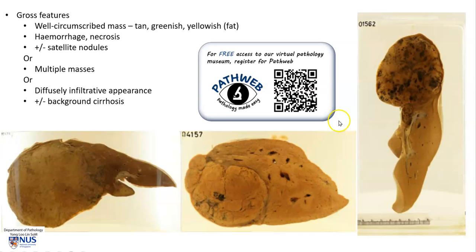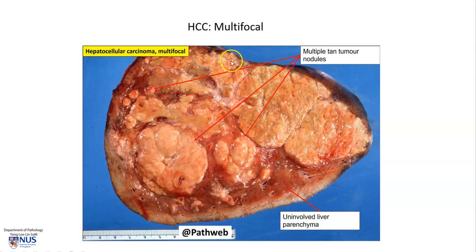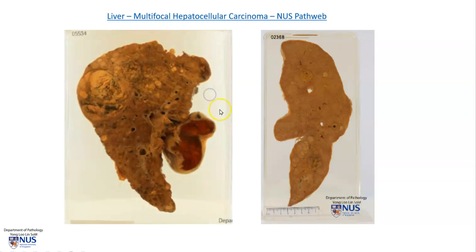All these virtual pathology specimens are taken from our free online pathology resource PathWeb. You can scan this QR code to register, or the registration link is also found in the video description. Here is an example of hepatocellular carcinoma with this fleshy tumor arising on a background of cirrhosis. Here is an example of a multifocal HCC with multiple tumor masses, and in this case the liver does not show any background cirrhosis. And here are some other examples of multifocal hepatocellular carcinoma, in this instance also occurring on a background of cirrhosis.